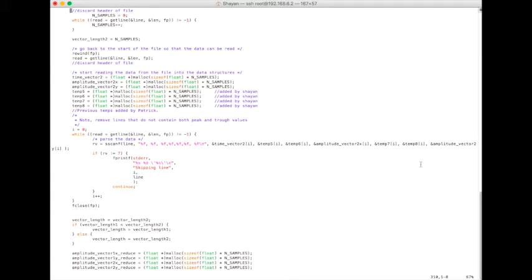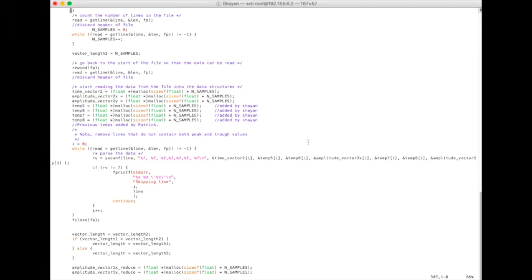sample time, accel X, accel Y, accel Z, gyro X, gyro Y, gyro Z, and magneto X, magneto Y, and magneto Z. And that is for 2 sensors. Now, by moving the amplitude vector 2x and amplitude vector 2y in the correct position, you can choose which column of the motion data output file you would like to perform the cross correlation and autocorrelation operations on.